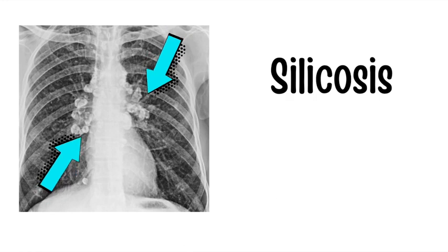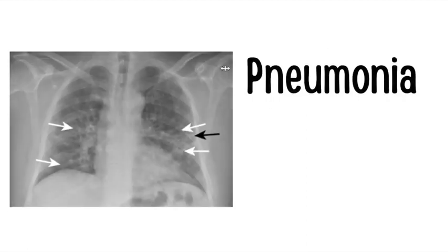These blue arrows are pointing to eggshell calcifications, which are seen in patients with silicosis. Remember that these eggshell calcifications are seen primarily in the upper lobes. Chest x-ray findings for pneumonia can show lobar consolidation or interstitial consolidation.